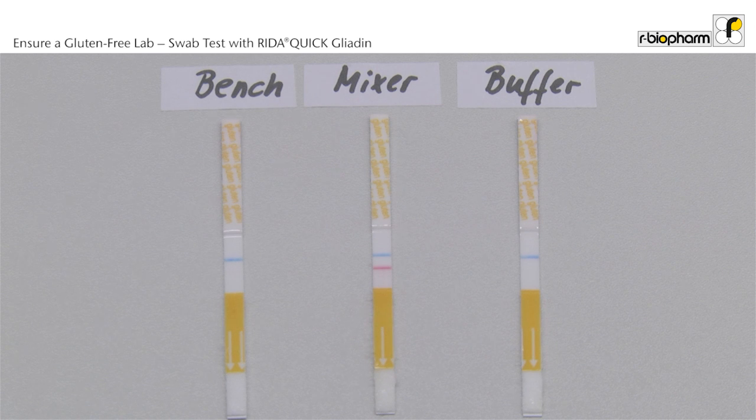The second dipstick is the swab from the lid of the mixer. It showed the blue control band and the red test band. The result is positive. So the lid is contaminated and needs additional cleaning.